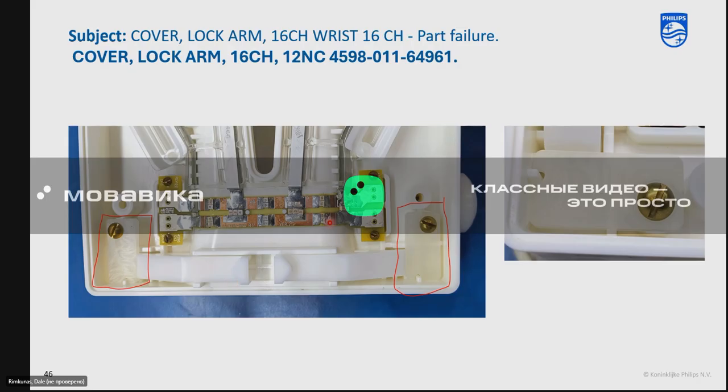Here's a wrist coil. A different error with the wrist coil is the locking mechanism from the inside. When you would close the lid, it wouldn't close and lock all the way because this little plastic retention piece here wouldn't stay locked on the spring. And it's simple. Look at that, just a little piece of white plastic. You can open the coil and fix that.